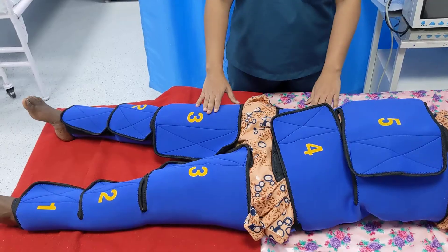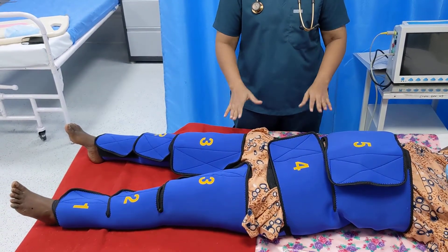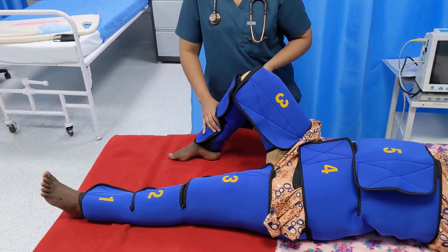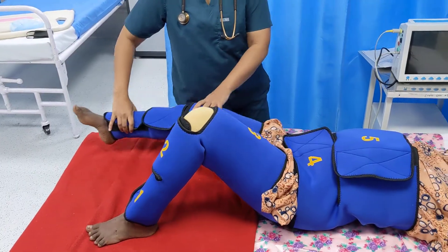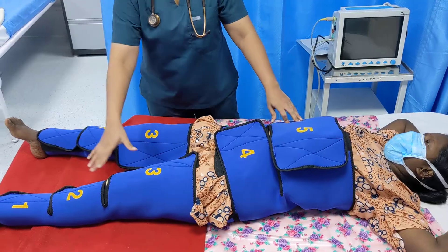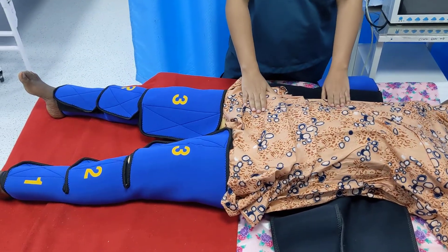There is one situation where this removal protocol is not followed: when the patient is taken to the operating theatre for surgery. If a vaginal procedure is required, the garment need not be removed at all, since the patient's knees can be easily flexed and the patient placed in lithotomy position. For abdominal exploration, only the pelvic and abdominal segments need to be removed, while the leg segments remain in place.